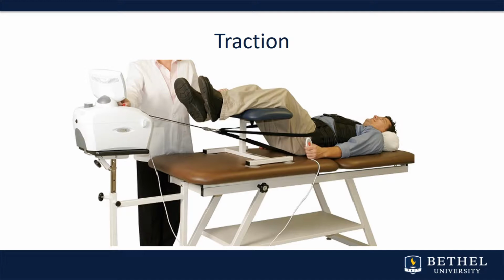If your patient is claustrophobic, this can be kind of a freaky thing. So you may get somebody set up and they just can't tolerate it because it makes them feel closed in. These have to be really tight when providing the traction, or else they'll slip.